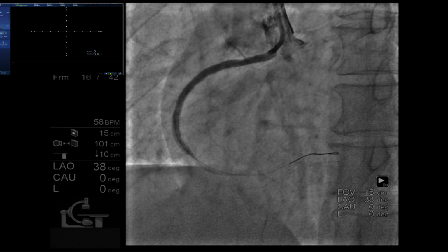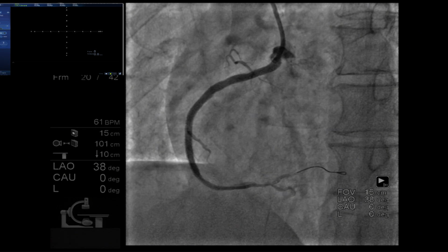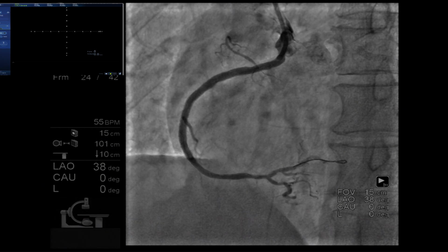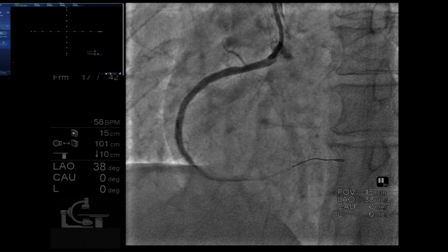What stents were there? Promus Premier. The proximal links are made more sturdy because we had a lot of longitudinal compression with the previous versions of the Promus. So now Promus Premier is fortified in the proximal region, so we don't see much longitudinal compression. But still it can happen, if the guide hits that edge.